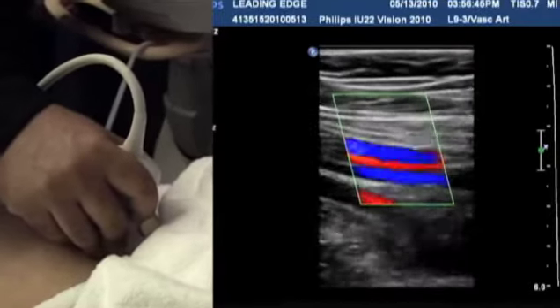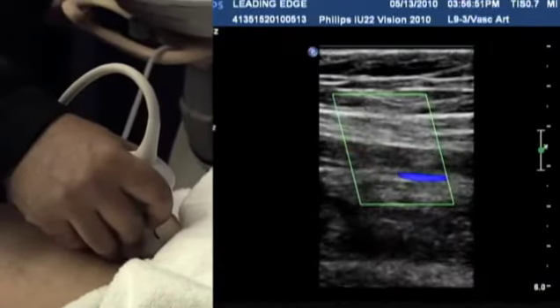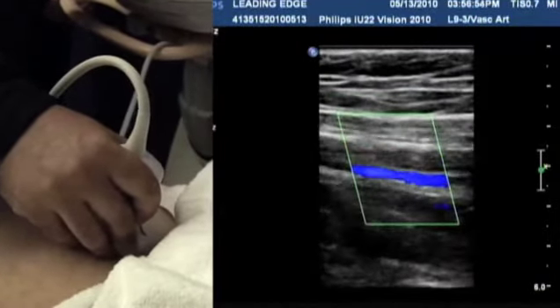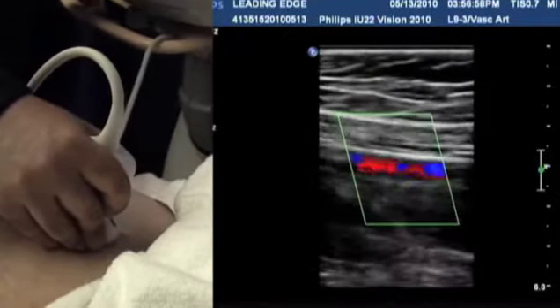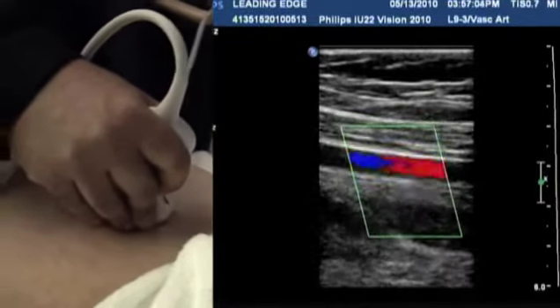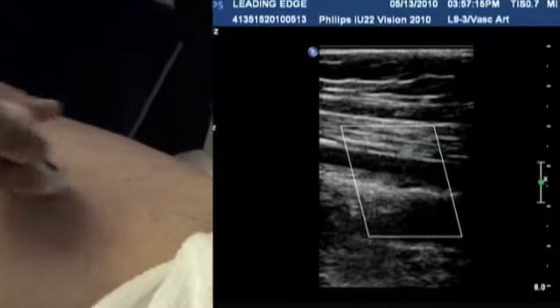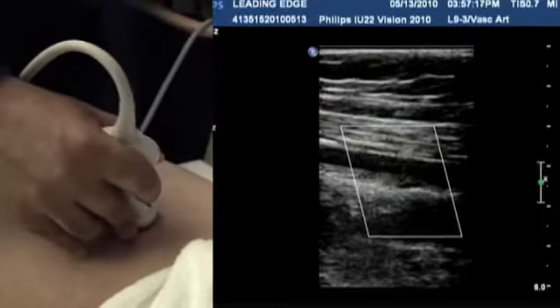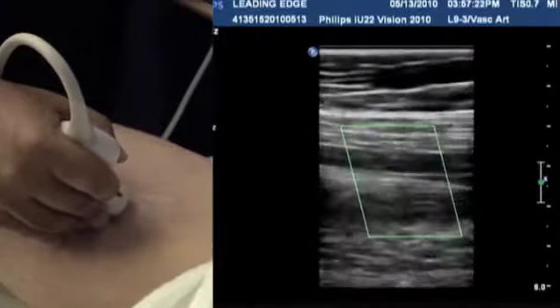And I think this is a huge time saver because the color flow image, in fact, will give me a good idea about whether or not there is any significant disease along the length of the SFA in terms of occlusion and stenosis. And in the absence of color flow changes that would make me suspicious, I just scan along the entire length of the leg. I'm just going to freeze this for a second and get a little bit of gel. Again, just pick up where I left off. Allow the color to be my guide, work my way down the leg.